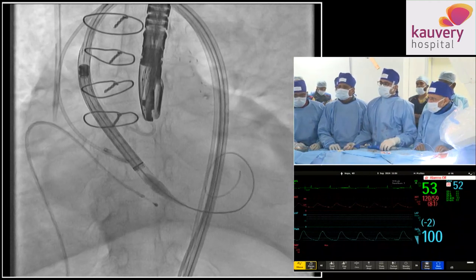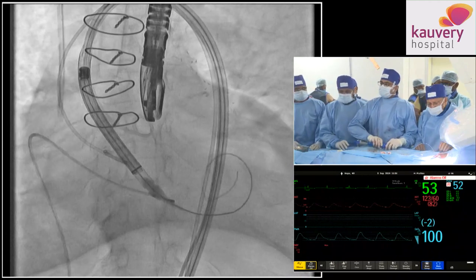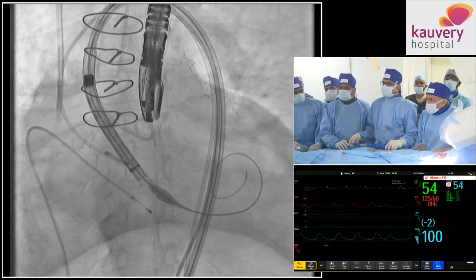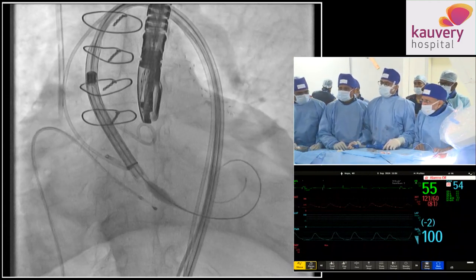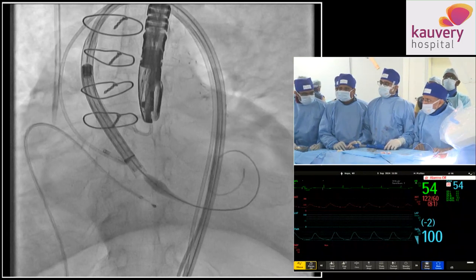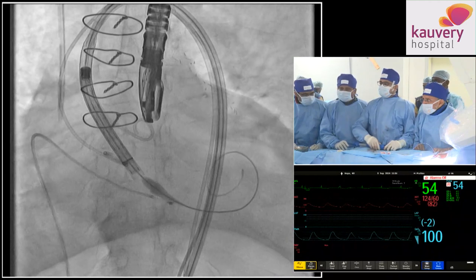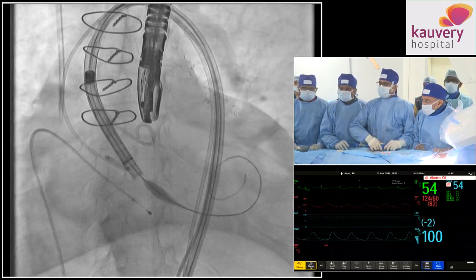Yeah. I am going a little bit deeper. Now it is okay. We'll start. Yeah, I wouldn't go deeper than that. Yeah, slow. It's going a little bit deeper. I'm positioning it up. Okay. So we're going to start deploying. Yeah. Slowly. Very slow. No. Just hold on.